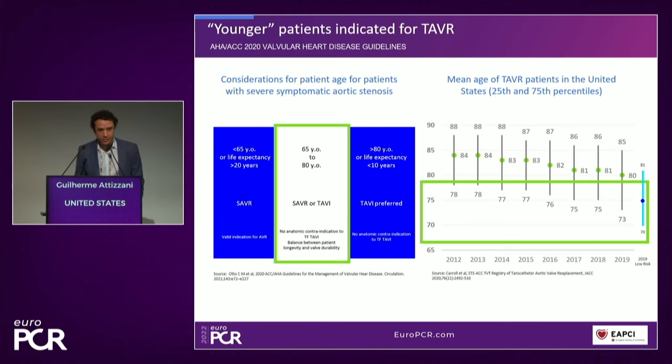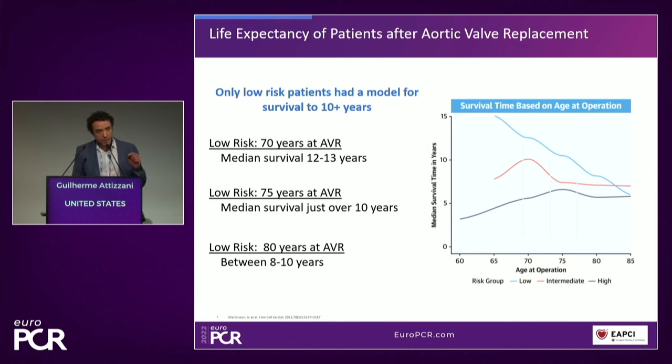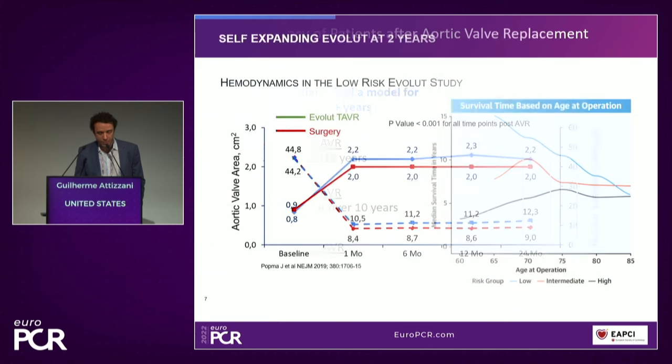Obviously, as we discussed here in the beginning of the session, the age of the patients we are treating with TAVI is progressively reducing as we treat lower risk patients. In that gray zone in the middle, between 65 and 80 years old, these are the patients that we are treating very often today, and we have to address those aspects that I mentioned before. So my goal here is to show that one of these aspects, the durability of Evolut, is very well consolidated in this scenario. Importantly, the life expectancy of these younger patients we are going to treat is 12 to 13 years. So we have to really take this into account when we decide which valve we are going to pick for our patients.